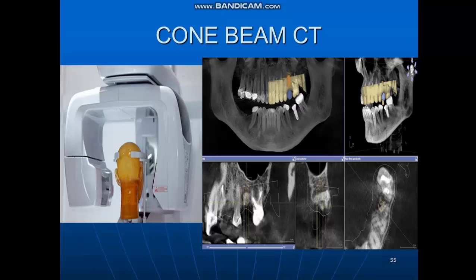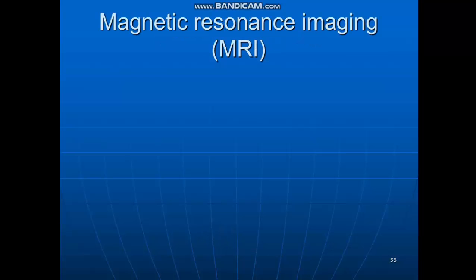These systems have been sold in different countries since the early 2000s and are increasingly used by radiologists and dental professionals for different clinical applications, including dental implant planning, visualization of abnormal teeth, evaluation of the jaws and face, cleft palate assessment, diagnosis of dental caries, endodontic diagnosis, and diagnosis of dental trauma. These are all the main indications of cone beam computed tomography.